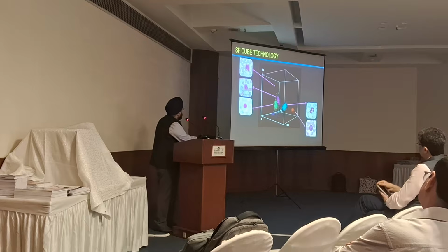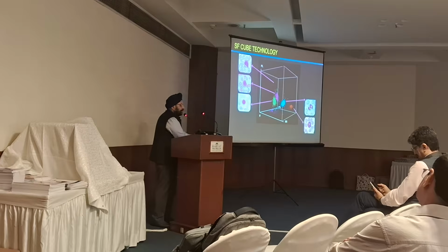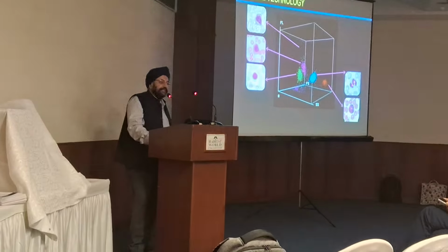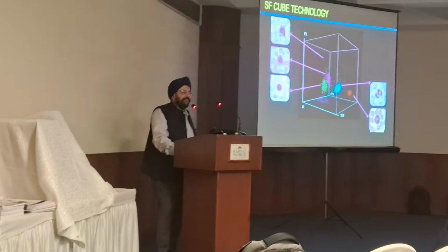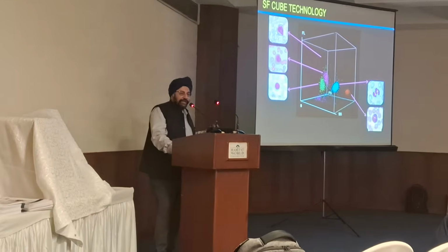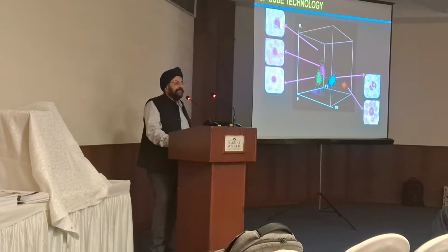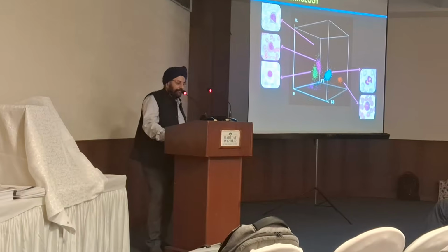These small tiny green dots above the monocytes, these are the HFCs, or on some analyzers they are also called HFLCs, high fluorescence cells or high fluorescence lymphocytic cells. These are nothing but your old fashioned Downey cells, viral lymphocytes, transformed lymphocytes, call them as you may. These are primarily increased in most viral infections, and also increased in certain lymphoid malignancies.